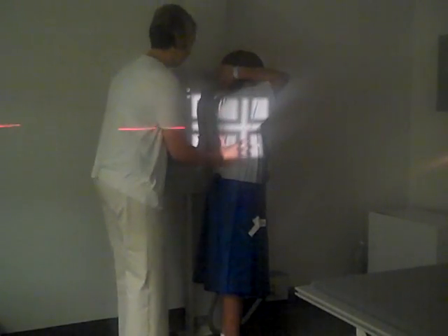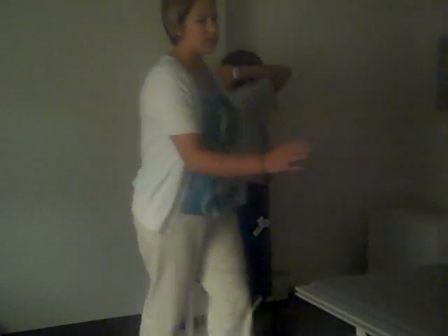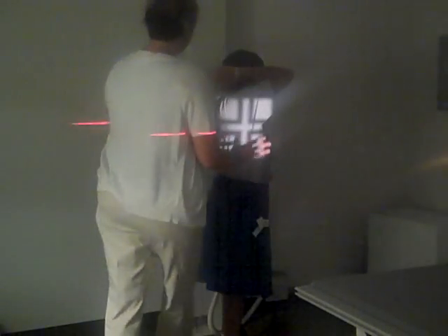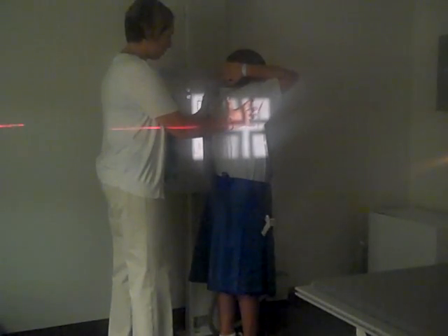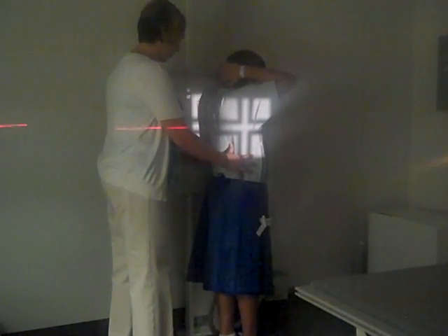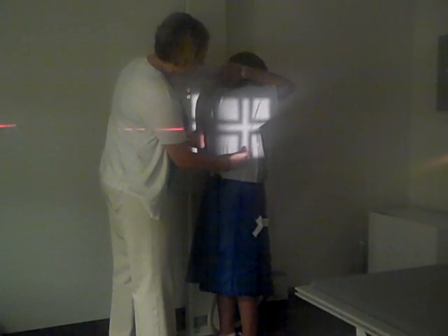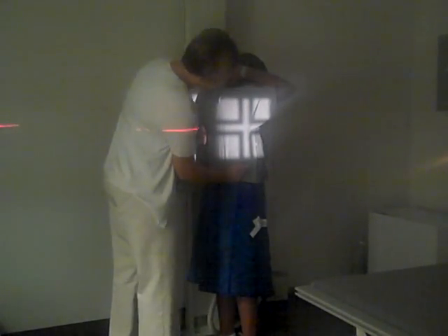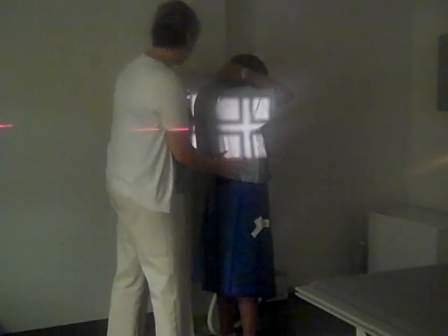Chin up for me. One thing that I tend to do is make sure that the front shoulder is a little more rotated forward from where I think it's lateral. I'm lining up so that my crosshairs are along the axis of the axilla. I want to make sure that I've got light posterior to my patient and that I'm including all the lung field front to back.